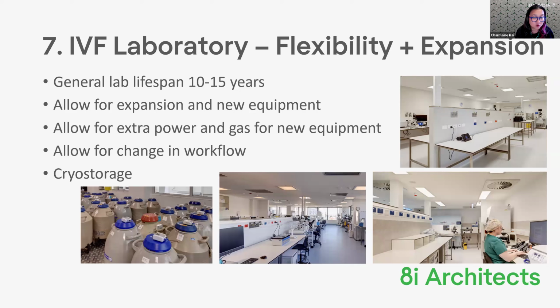Most facilities will grow a lot more than what you think, and a lot of times it's because the existing lab can't grow because it's hampered by the space you're limited in. So a lot of times I'll say to people, look, if you're 500 now, let's allow for, say, 1,000 or even 1,250, just so you've got that future proofing, because it will grow.